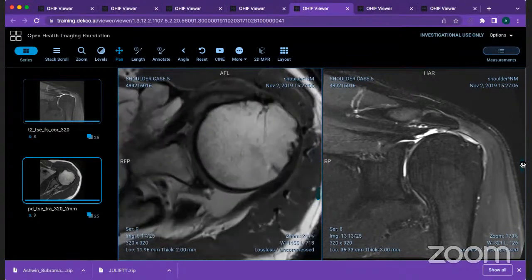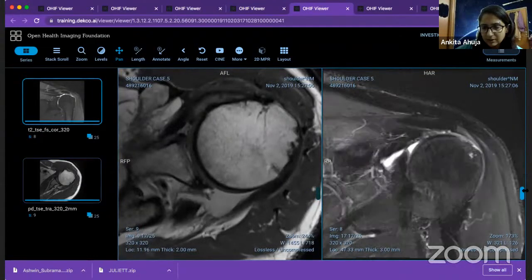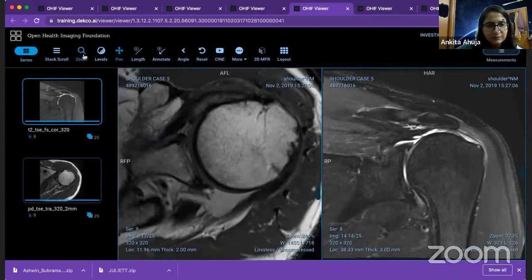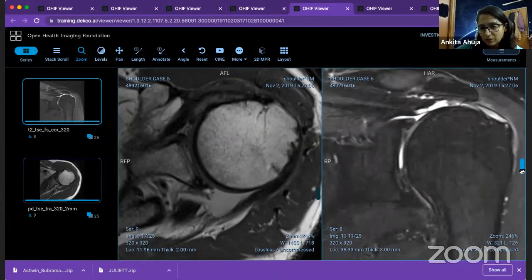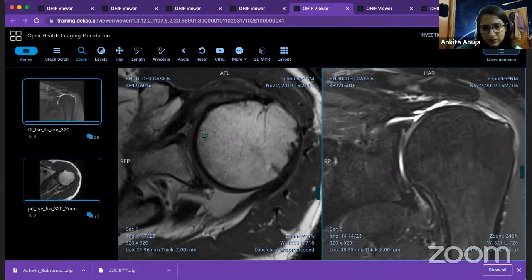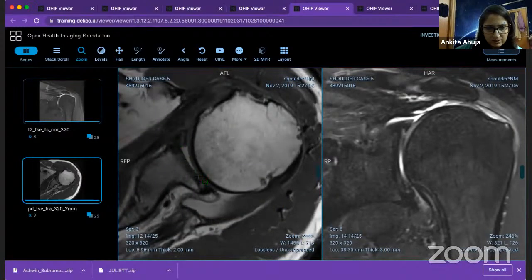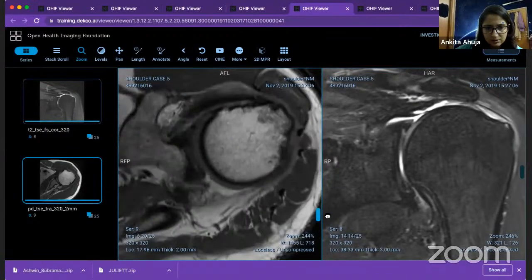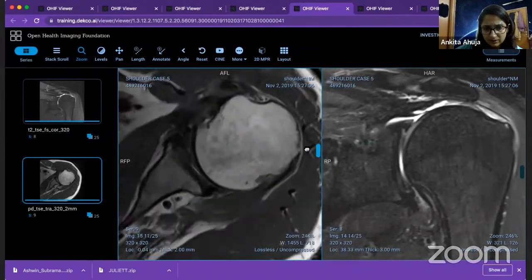Where? I'll show it on the other aspect. So this is a little difficult zone with the shoulder, but grossly it's normal. So if you see this bright line over here, and similarly this gray thing over here and here, centrally the cartilage is a little thin. So otherwise this cartilage looks pretty fine over here and here. Cartilage, gray line, doesn't look really bad, right?